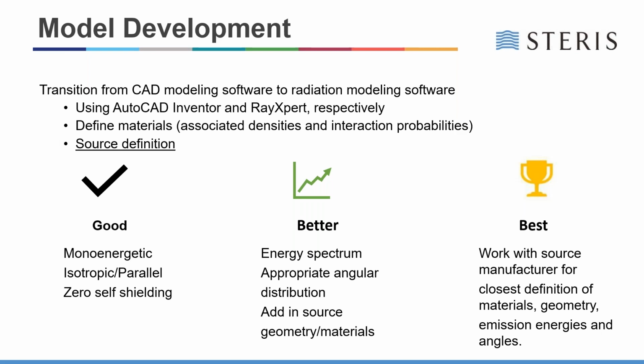for gamma, and you can see the slash there for parallel being some type of an accelerator-based system, and zero self-shielding, where by zero self-shielding we're referring to the interaction of source particles passing through, attenuating or scattering with the physical source infrastructure. This could be physical cobalt, or the cladding surrounding the sources in the cobalt system, or gamma, or structural materials of the scan horn itself, or an accelerator-based or electron or X-ray source system.